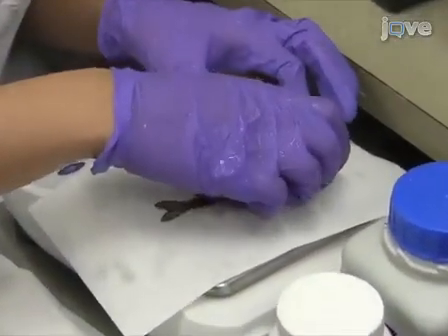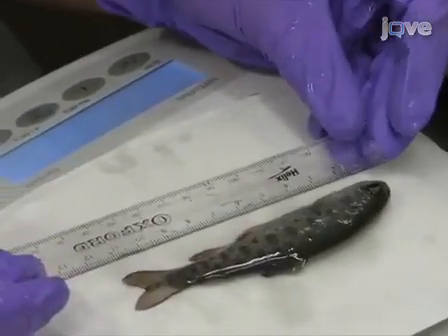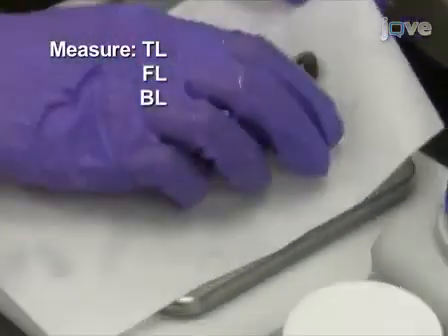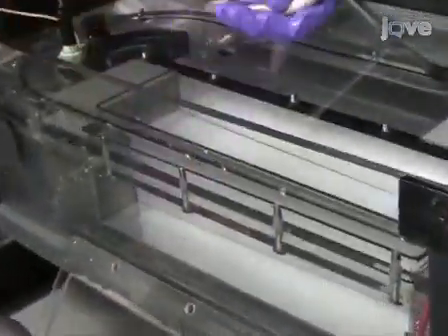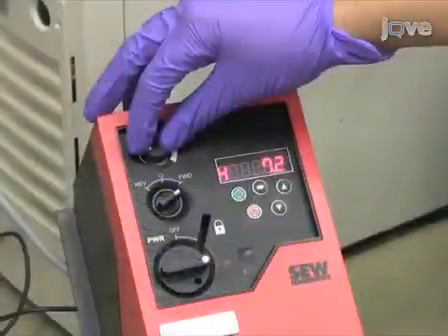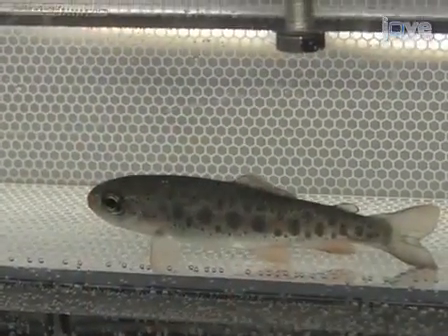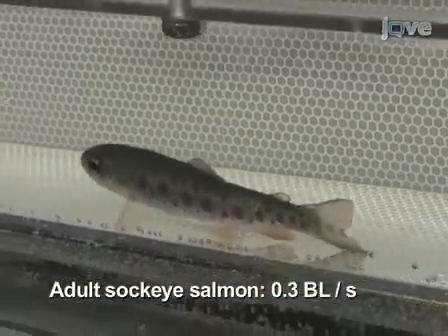Anesthetized fish are then sexed, measured for mass and length, and given a cursory external exam of their condition. Measure the total length, fork length, or body length. Introduce fish into the swim tunnel as quickly as possible to aid in recovery. Set the flow rate such that fish will be able to rest on the bottom while barely swimming. An example rate for adult sockeye salmon is 0.3 bl per second.